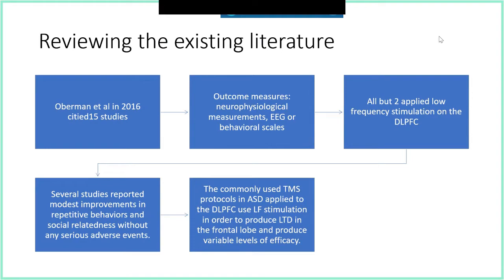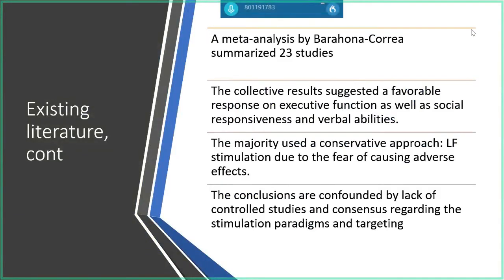And there is also a very good meta-analysis on this literature. Essentially, the collective results tell us that there was a favorable response in terms of social responsiveness, language, executive functioning. However, the majority of the experts used a very conservative approach of low frequency stimulation.